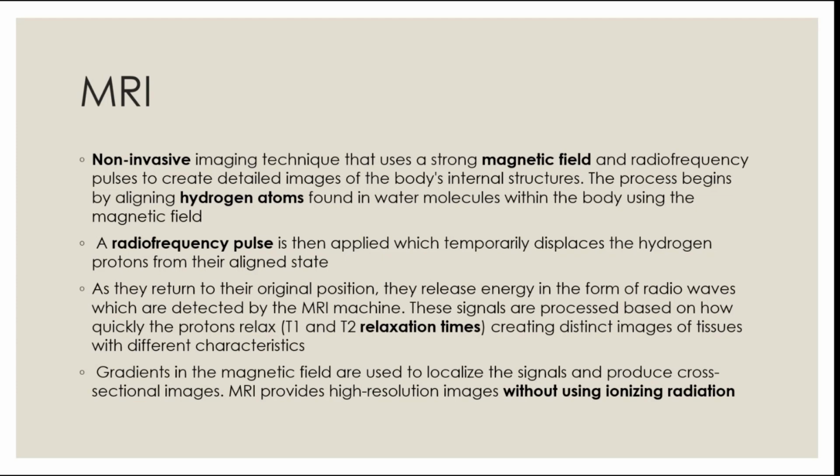The most important thing about MRI is that it is not invasive, and there is no ionizing radiation produced. So you can use it when there are contraindications to CT and X-ray, especially in pregnant women or young people that you don't want to expose to that dose of radiation.